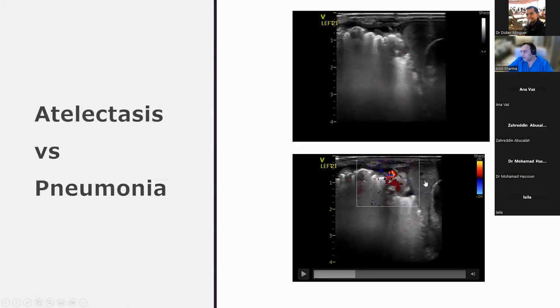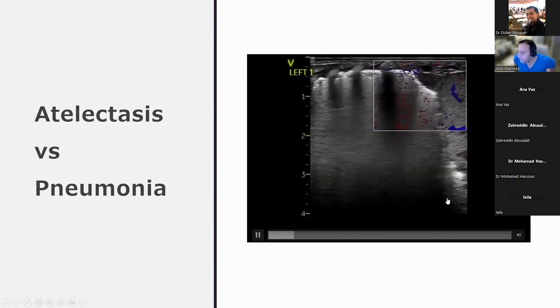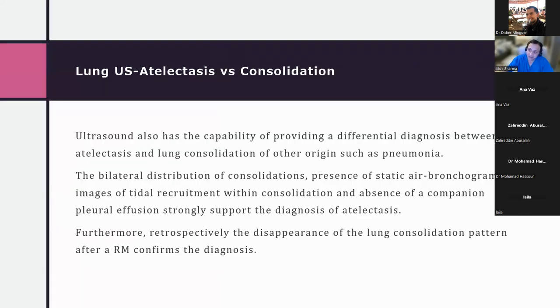And this is pneumonia for you. So can you see how focused this particular area looks with the blood vessels? Spend some time there. Keep your Doppler there. Try it a mental model. And if you're confused, just go back to what we said. Get a second person, a fresh pair of eyes to come and have a look at it. But these are just some of the features that help you differentiate focal atelectasis, diffuse atelectasis, consolidation from pneumonia.